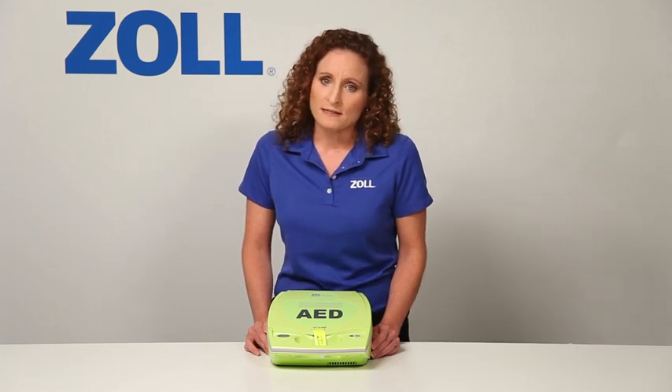Now let me demonstrate the major benefit of the AED Plus. It provides the best support to someone who is rescuing a victim of sudden cardiac arrest. Most of what I will demonstrate is not available in any other AEDs.